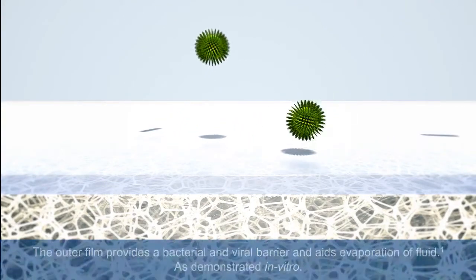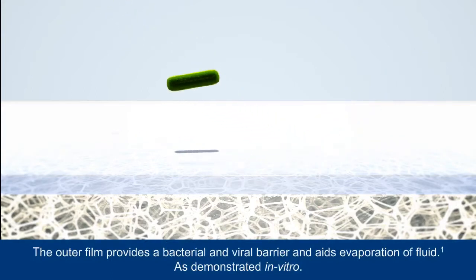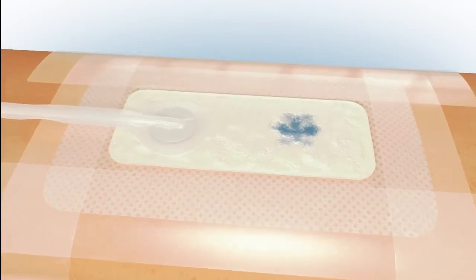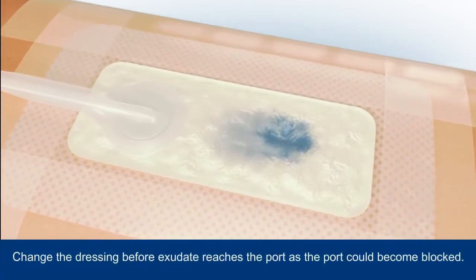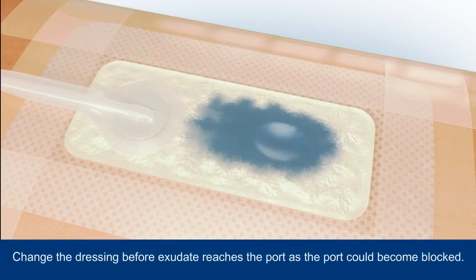A showerproof top film provides an effective bacterial and viral barrier in addition to aiding evaporation of fluid. Exudate will initially be absorbed into the dressing directly above the wound and then throughout the dressing, locked away in the hydrofibre core.